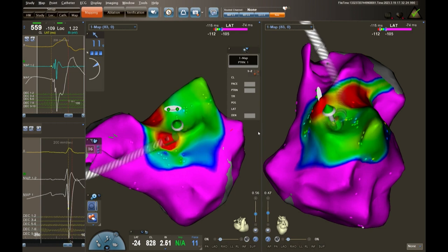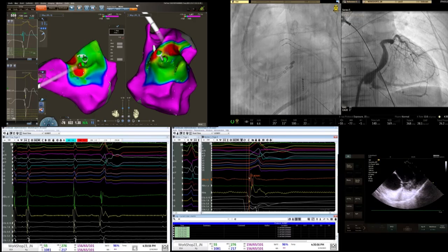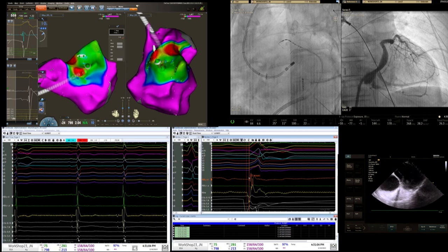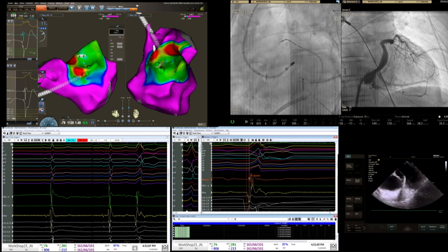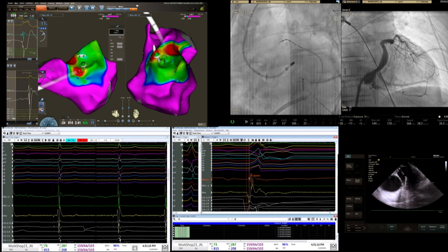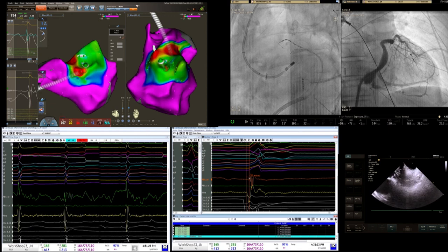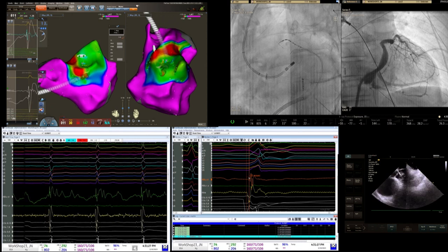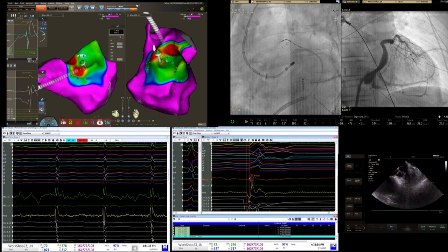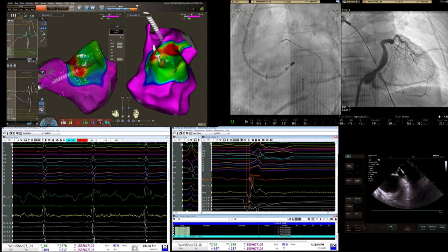We mapped everywhere. The left coronary cusp was later than the endocardial site. We have an area earlier in the endocardium but it's not pre-QRS - it's the closest we have to the wire. So we're going to start here and give it a try at 30 watts.